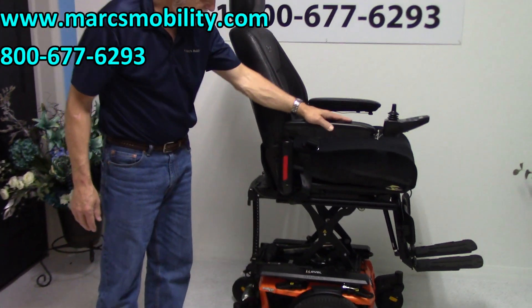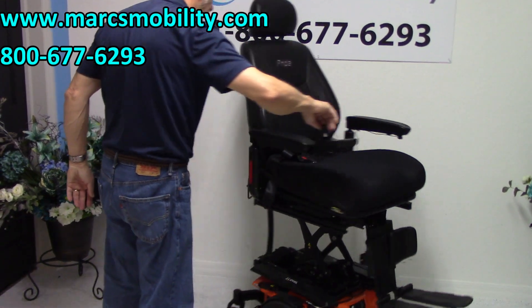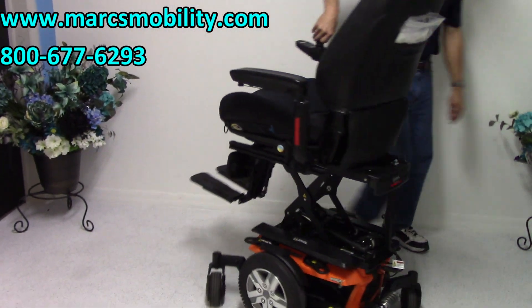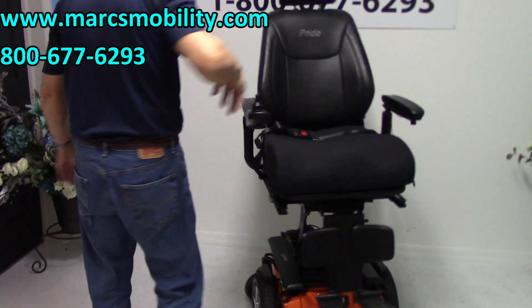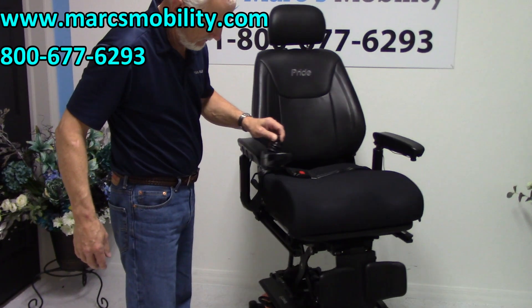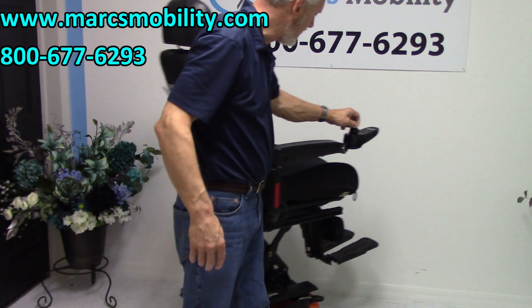This is a mid-wheel drive chair, so it turns on its own length. So if you were in a house and you wanted to turn in a circle, you could turn all day long with the seat elevated like this in your home, in your kitchen. These are also nice, quiet chairs.